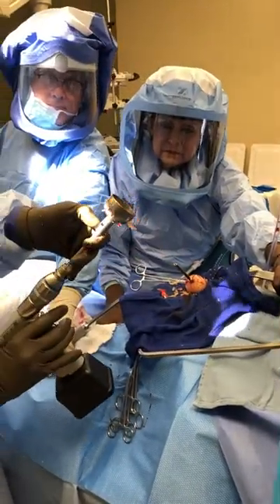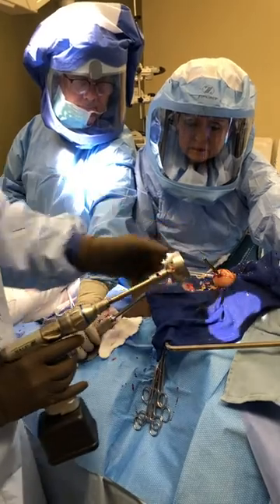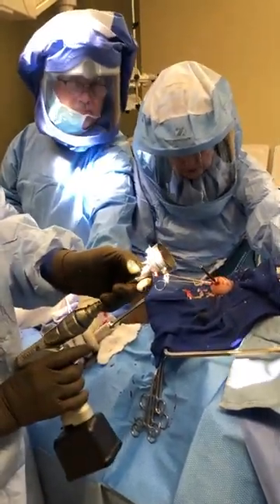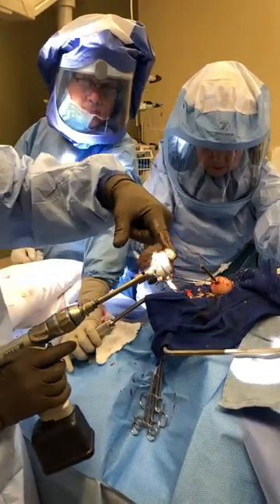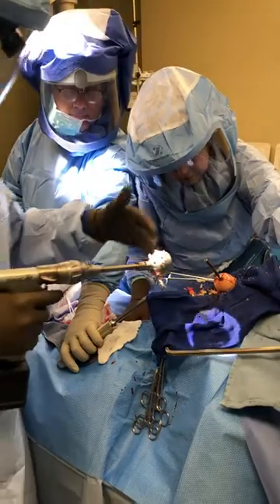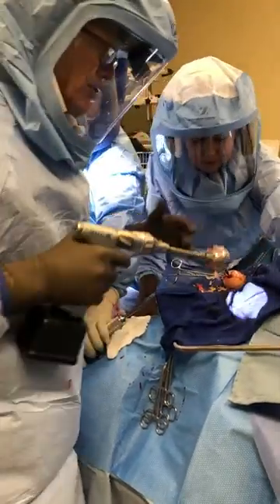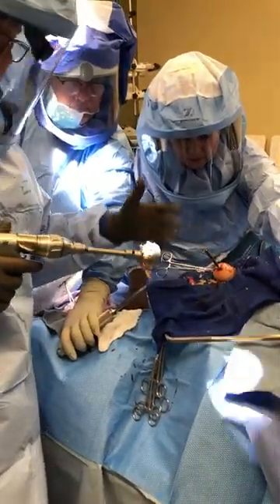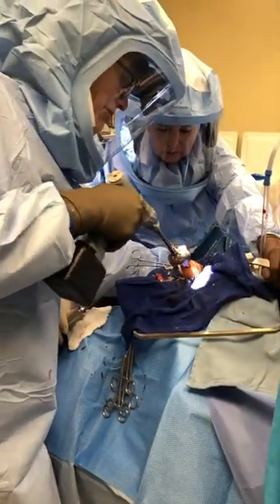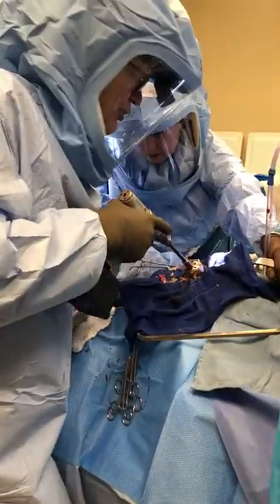This implant is designed for that post — whatever size you choose — to come up right in the middle of the box, and there's a little line that tells us we've taken six off. I can also watch at the head and neck junction to see how far I go down, so I have two different checks to make sure I don't goof it up in case the post moves. But the post is pretty solid — it hardly ever moves, and this guy has really hard bone.